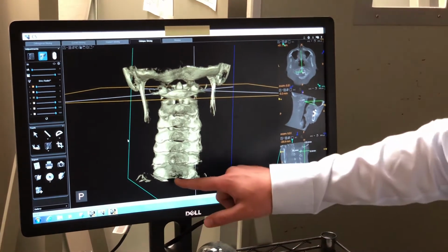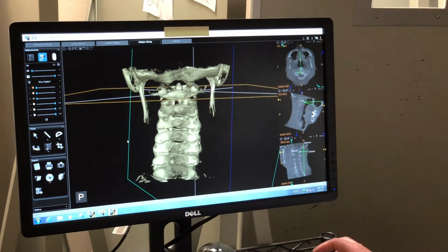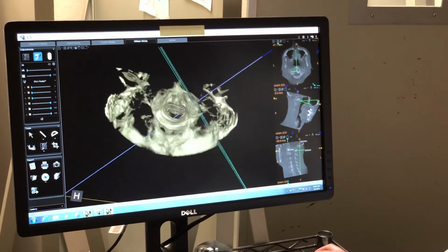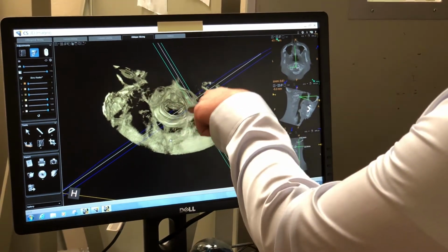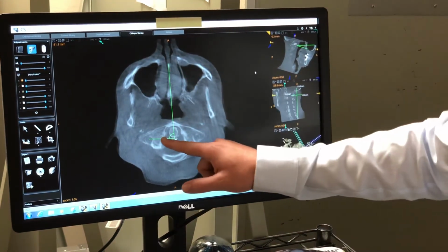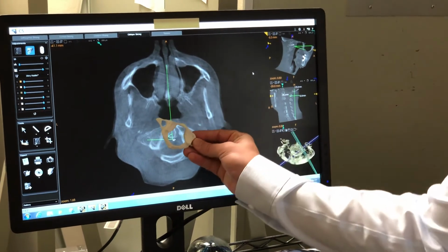You can see a little bit of a scoliosis here in the neck curve. Really what's going on here is that quite literally her head is not on straight. Okay, so there's been a big rotation. Looking down the spinal canal here, you can see a rotation at the C1. If I take this image in a more traditional 2D form, we can see that there's been about a 5-degree curvature in the neck, like that.